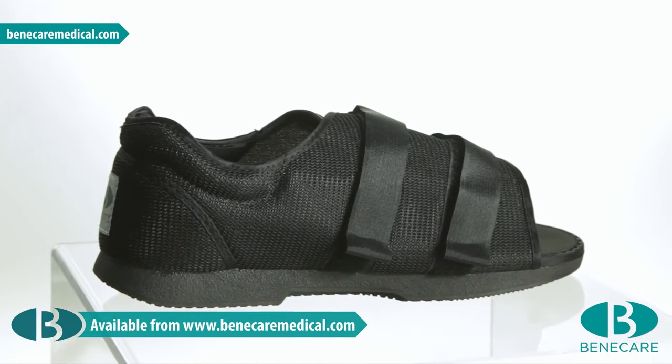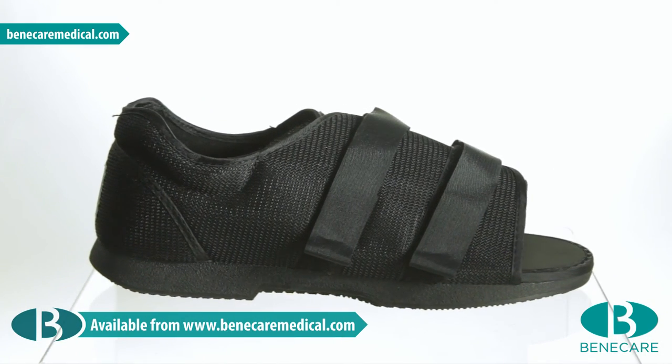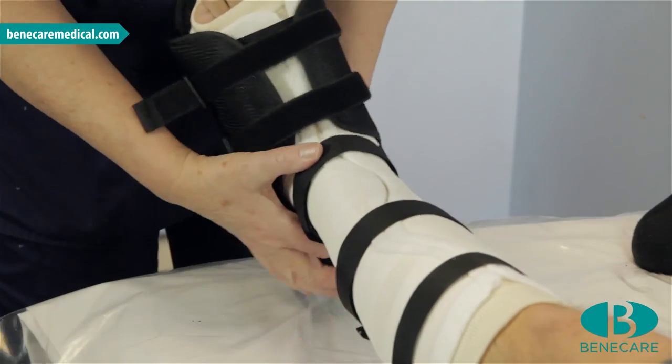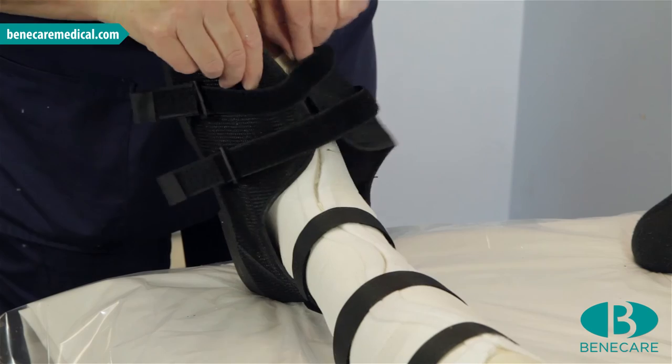If clinically acceptable to weight-bear, apply the Benecast Post-Op-Shoe. This is the ideal choice to provide comfort and support for the patient, with excellent protection for the cast.